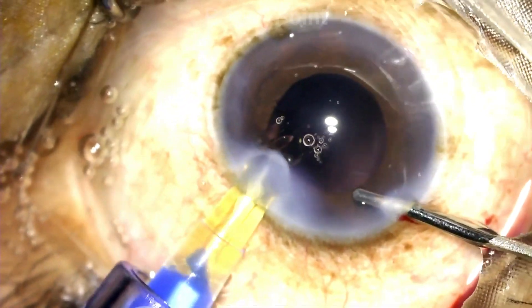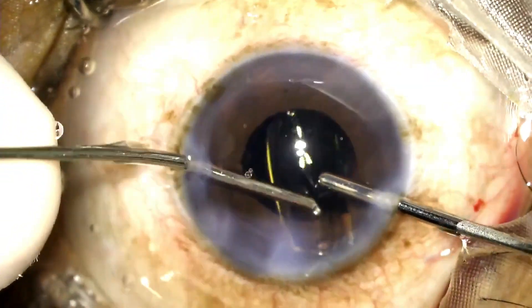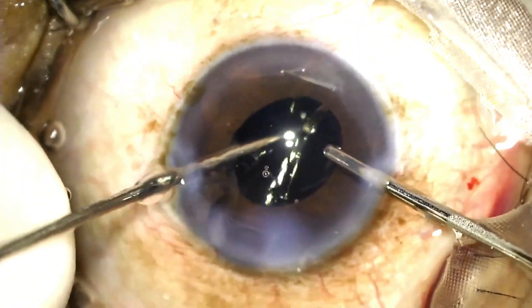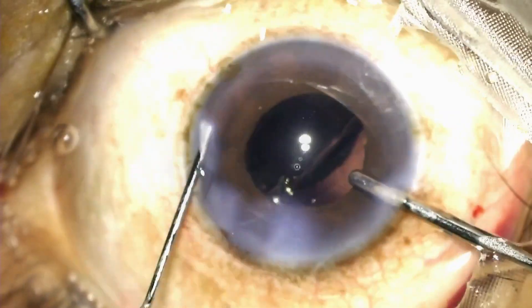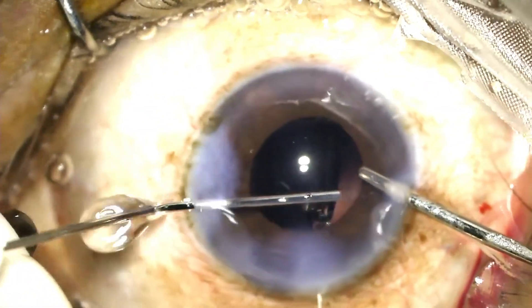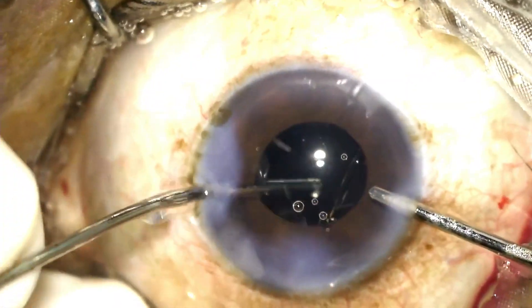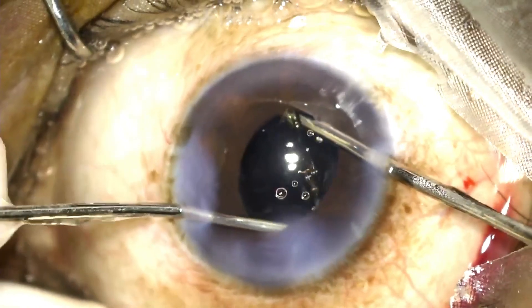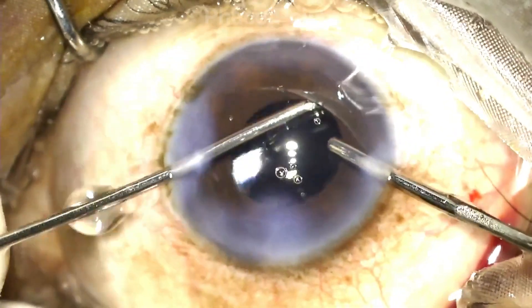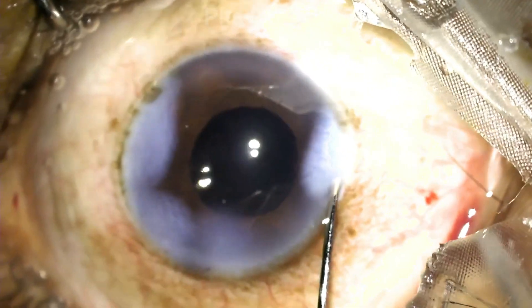I now proceed to implanting the intraocular lens. The important point while implanting the lens is to ensure — because of limited visibility — that the IOL completely goes within the capsular bag. You need to ensure that none of the haptics accidentally slips into the sulcus. Please note how both haptics are stuck to each other; this sometimes happens with a hydrophobic lens. It's very important to ensure that both haptics get unstuck prior to ending the case, because if left like that you might end up seeing a haptic in the anterior chamber or in the sulcus the next day. I ensure both haptics find their place within the capsular bag, then proceed with performing a stromal hydration, and this brings us to the end of this surgery.